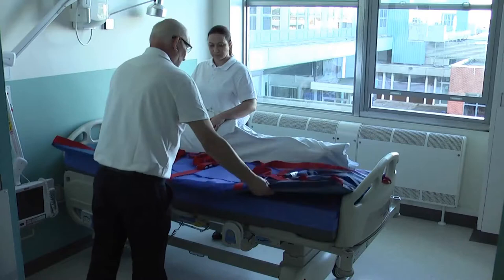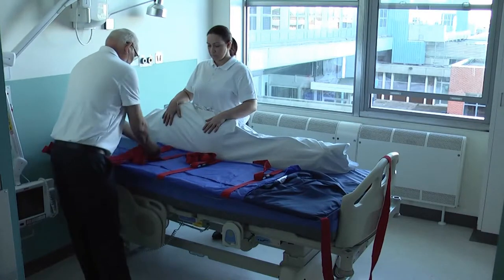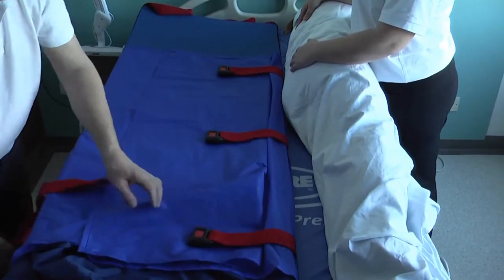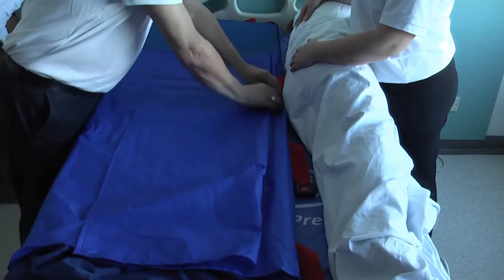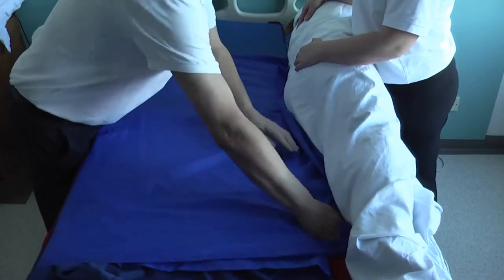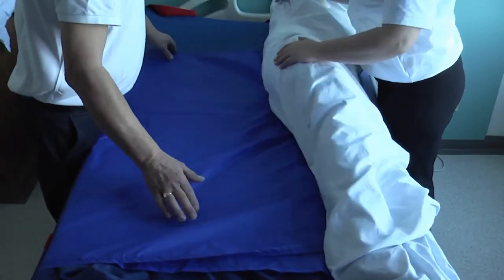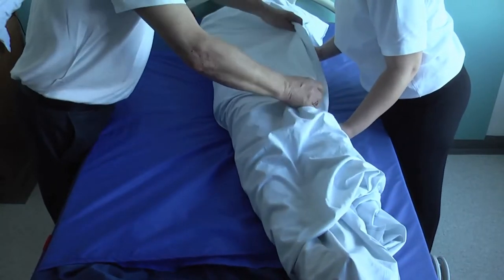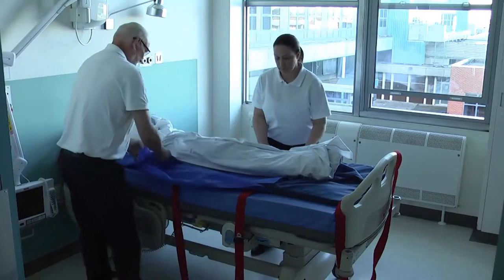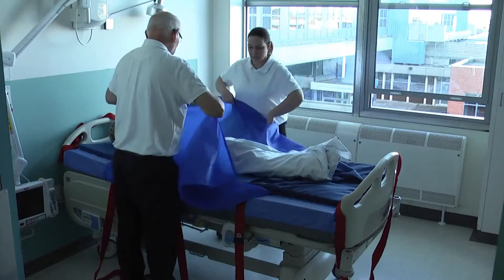Carefully place the ski slide pad alongside them with the black buckle facing the patient but tucked out of the way. Lay the built-in slide sheet closest to the user over the ski slide pad followed by the second slide sheet. Carefully feed the top slide sheet underneath the user. Gently roll them back onto the ski slide pad and position them centrally using the slide sheet.